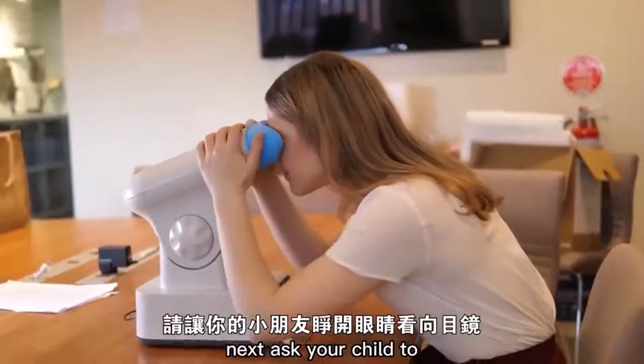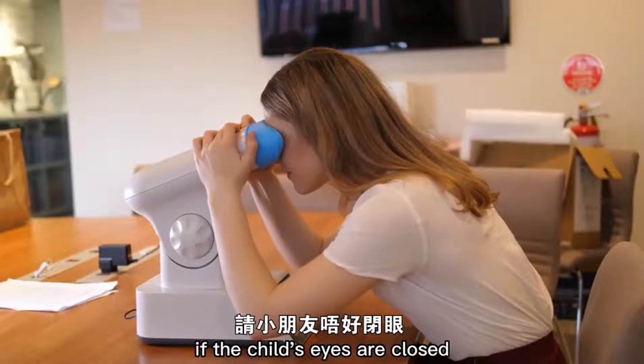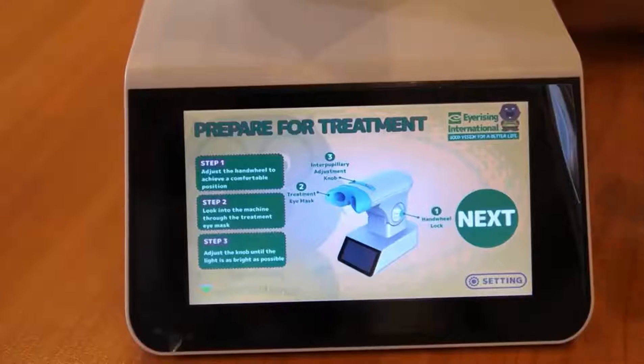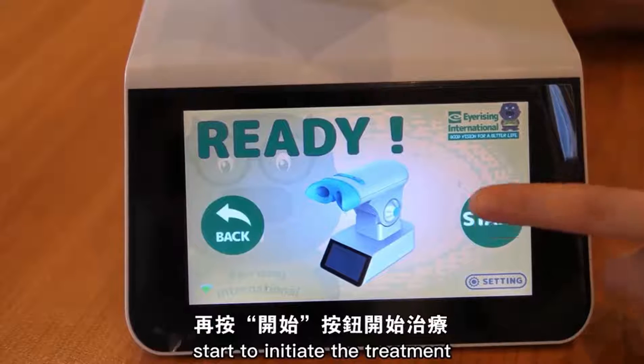Next, ask your child to look through the eyepieces with open eyes. If the child's eyes are closed, they will not receive the treatment. Press the next button to enter the treatment mode and press start to initiate the treatment.